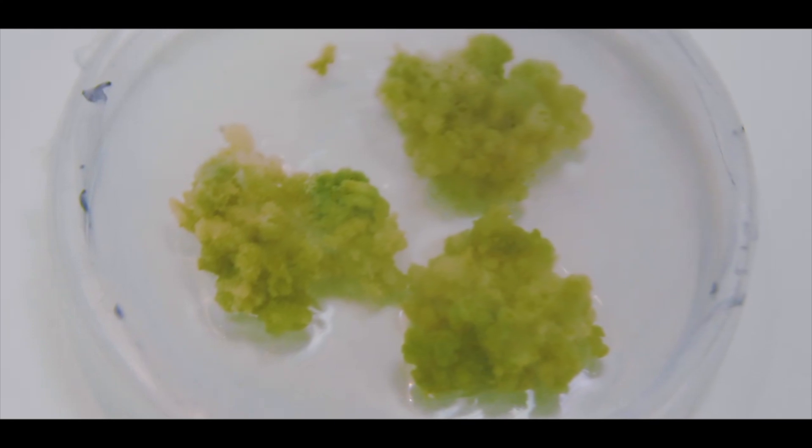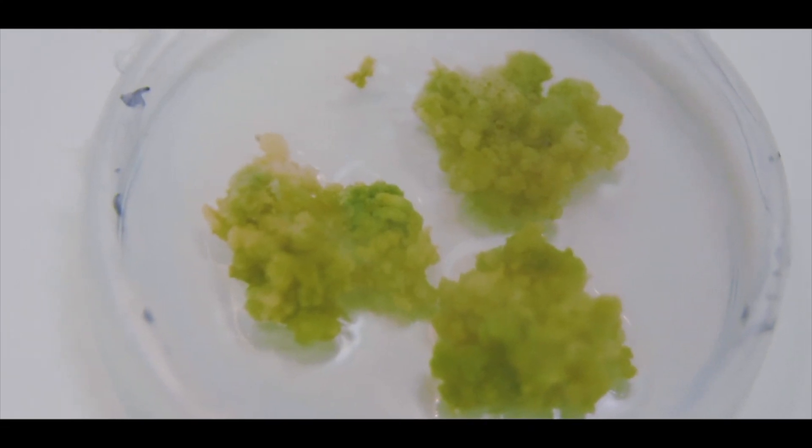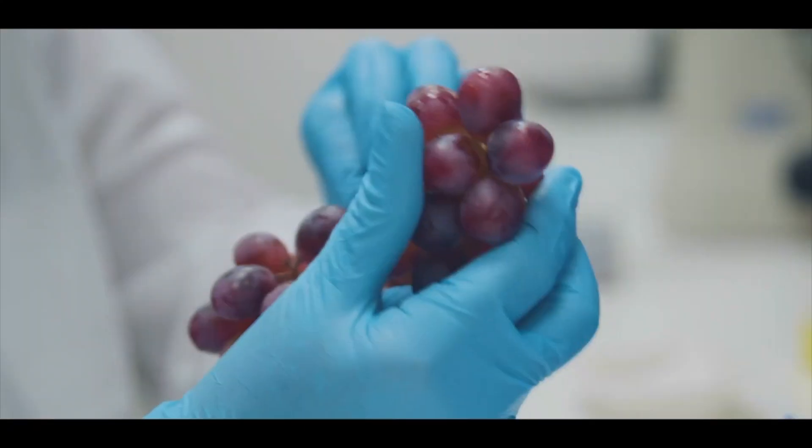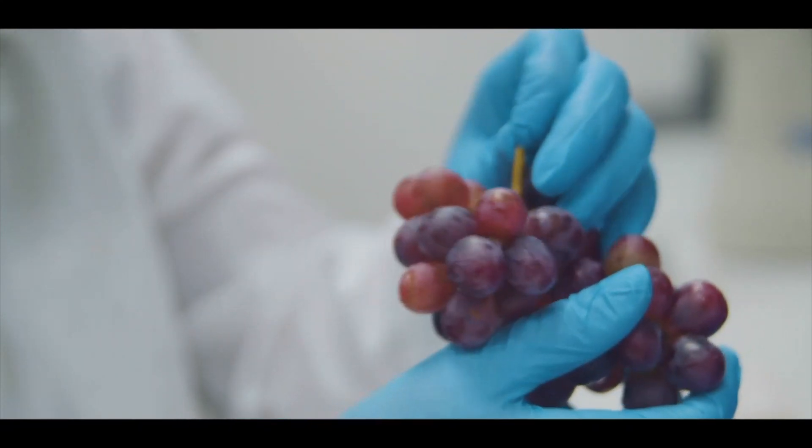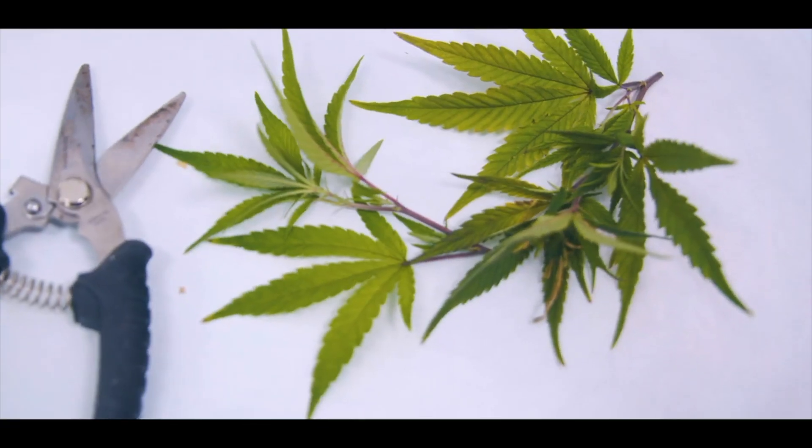These cells grown in the petri dish now constitute the cell bank. At this stage we have total independence of the mother plant and we will never use it again.